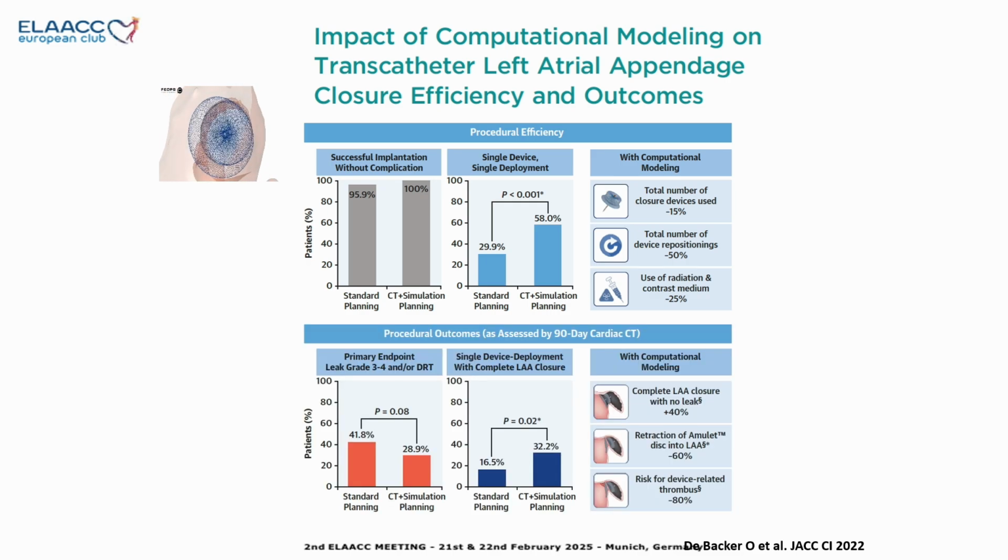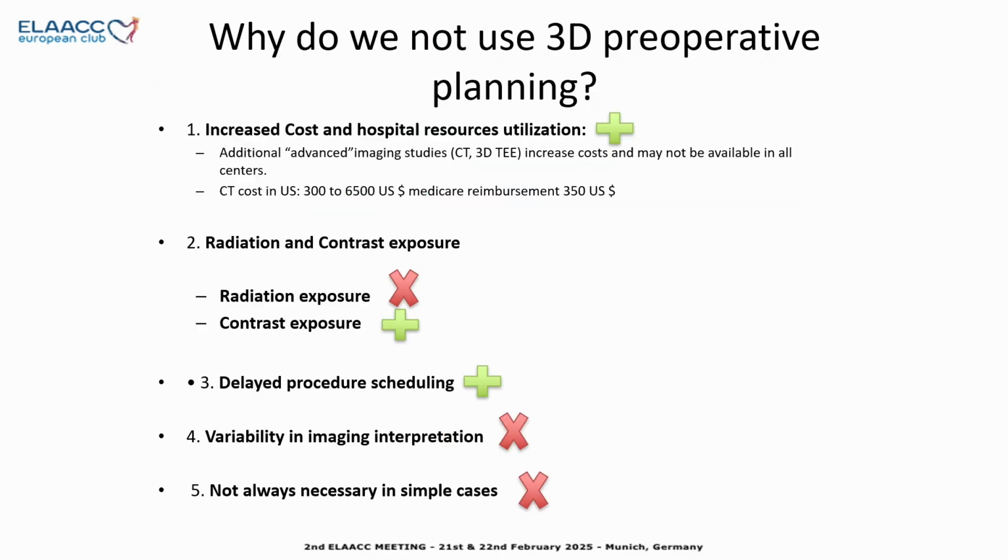And in terms of procedural outcome, as assessed by the post-implant CT, there is a better sealing and a better complete occlusion of the patients, less leaks, and less risk of DRTs.